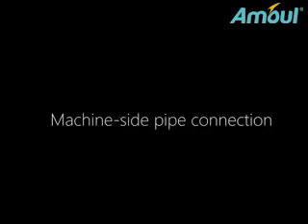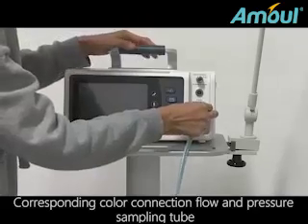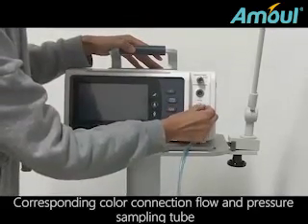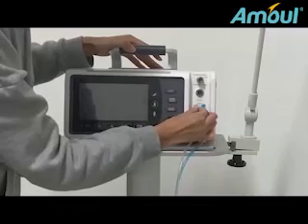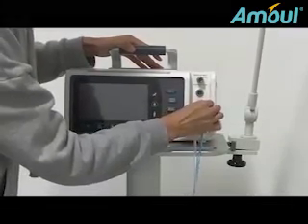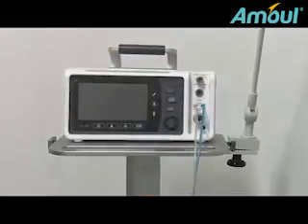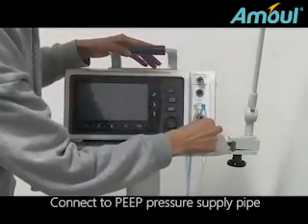Machine side pipe connection. Connect the flow and pressure sampling tubes with the corresponding colors. Connect the PEEP pressure supply pipe.